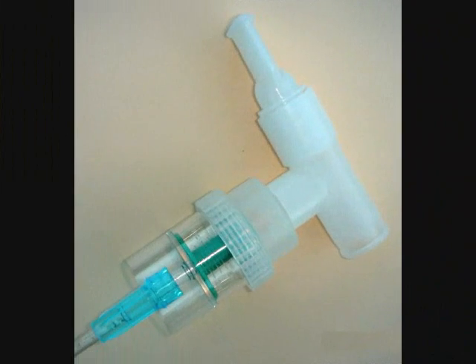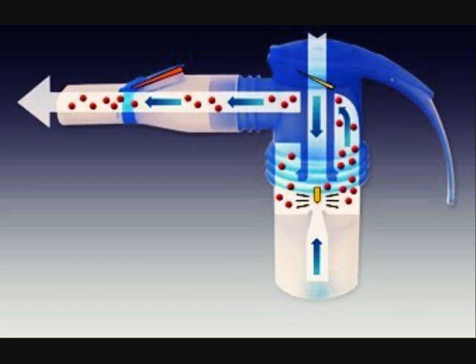The picture shown here is a jet nebulizer that uses Bernoulli's principle to convert a pool of liquid into a fine mist of aerosol particles. A jet stream of gas is projected at a high velocity across the end of a capillary tube. The gas jet reduces the pressure at the top of the tube, causing the liquid to move to the top, where it is continuously drawn off as aerosol particles that enter the outflow passage of the humidifier.